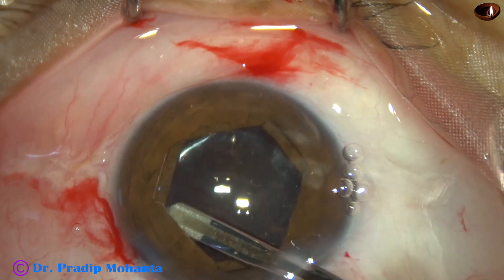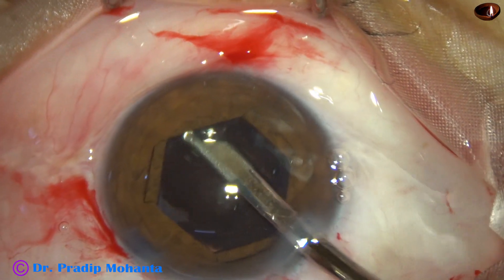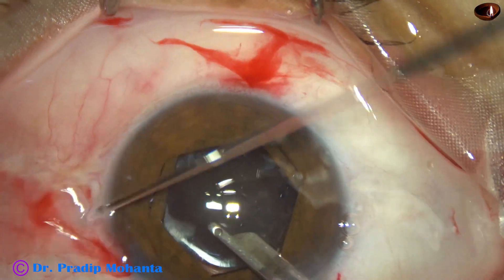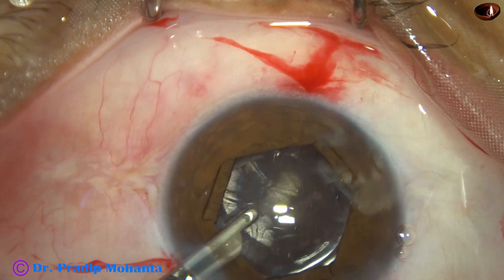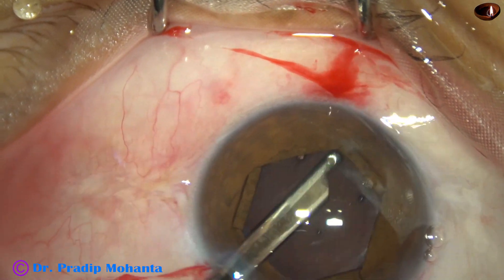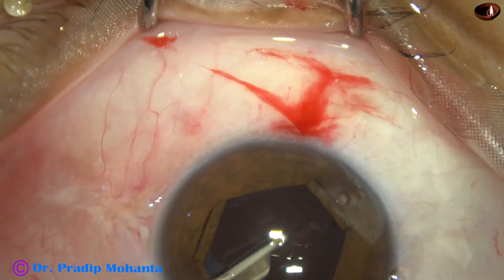And now I am removing the cortical matter from all around. Here there is some fibrous tissue attached to the anterior capsular rim at 2 o'clock and 3 o'clock. At first I thought it is cortex but it is not. There are some cortex at 9 o'clock and 8 o'clock, and I can remove those now very nicely. So without application of this pupil expansion device, this cleaning was not possible.